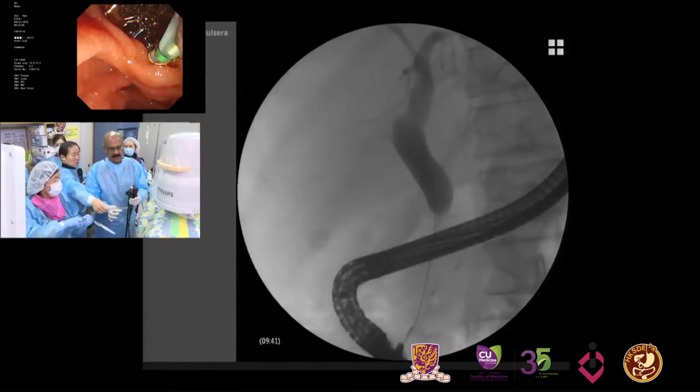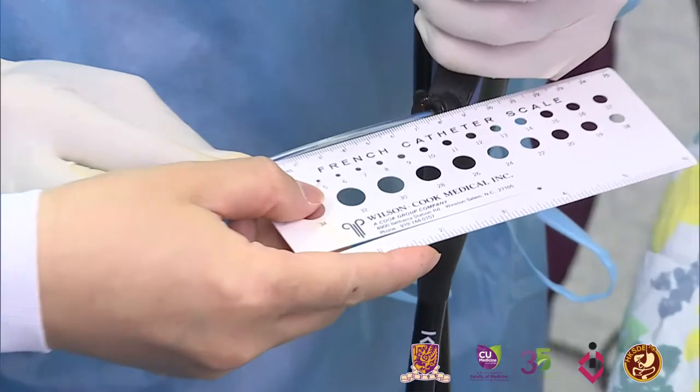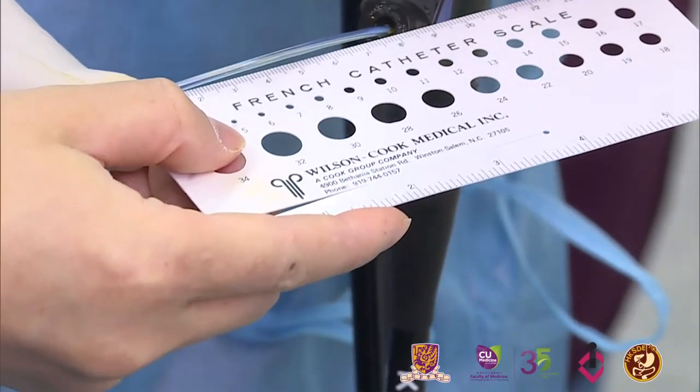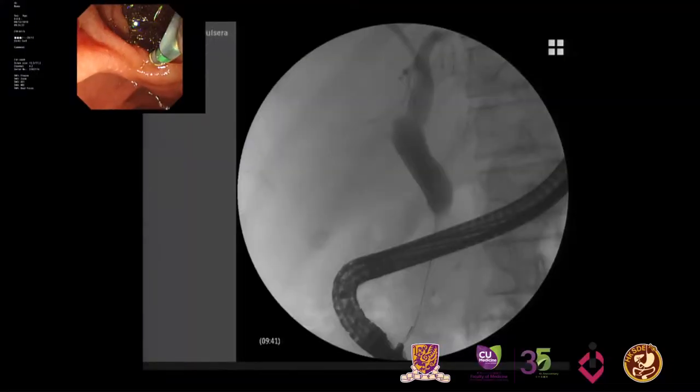So yeah. This is the length of the stricture now. Duong Van is measuring it. We always have this, it is almost seven centimeters. It's a long stricture. Okay. It's always important to have this scale with you. Made from Wilson Cook, very valuable.